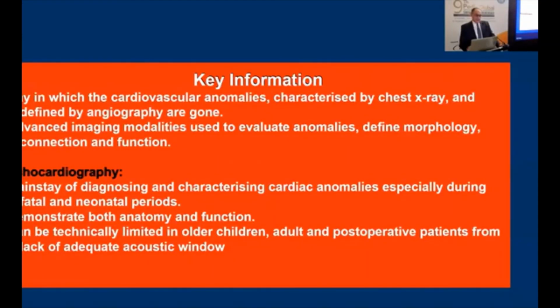To review the information we started with: cardiovascular anomalies can't be diagnosed only by X-ray, and the advanced modalities play more significant roles in the diagnosis and follow-up of these anomalies.